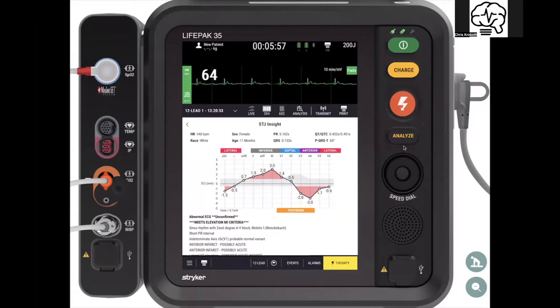So we have those reciprocal depressions plus the interpretive statement. The provider uses their assessment to answer: does our patient look like a STEMI — yes or no? What's cool about this is it's not just a blanket statement printed out at the top — it actually gives you mapping of where those changes are occurring and what is elevation versus depression.